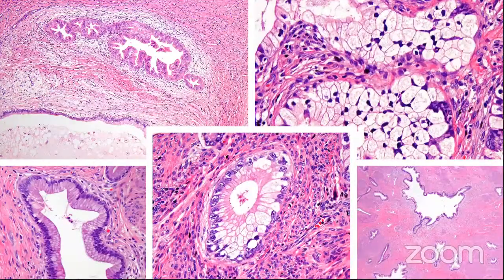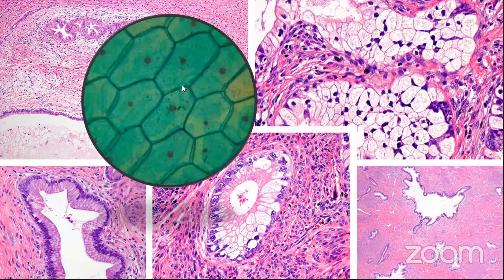And you can see here the variation in the histomorphology of these tumors, the abundant, voluminous, clear, bubbly eosinophilic cytoplasm with very distinct cell borders, which some people liken to plant cells, where you can see the cellulose lining. So the gastric type tumors have these very distinct cell borders. You can see here on the lower right, a tumor that maybe in the old days would have been called minimal deviation adenocarcinoma, and those are just gastric type adenocarcinomas that are at the very well differentiated spectrum morphologically.